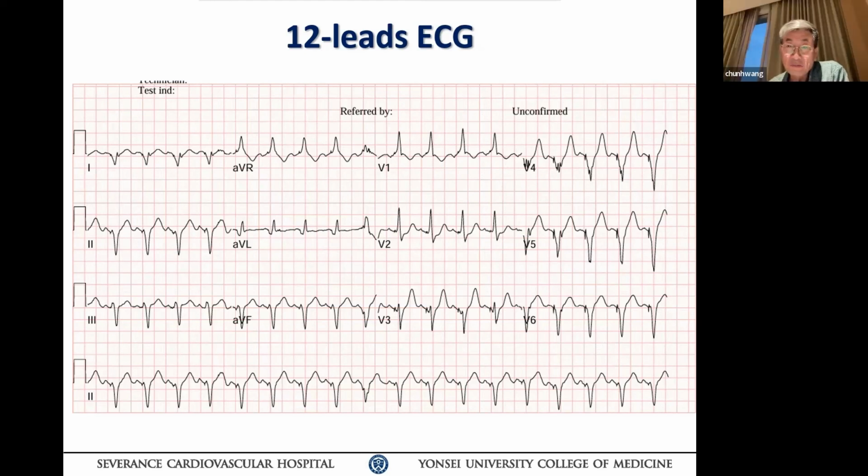So where's the second spike? Pacing, precordial lead. You can see the second spike. See, the first one is the LV, LV is first. Where is the RV pacing? Can you see? Then look at V4. You see that notching, blipping? Yeah, next one, downstroke. Yeah, that is the RV pacing spike. So we need to interrogate these spikes again. Maybe you need to adjust it. It could be even narrower than this, depending on how your timing is. So please check the timing of LV and RV pacing in this patient. Okay.